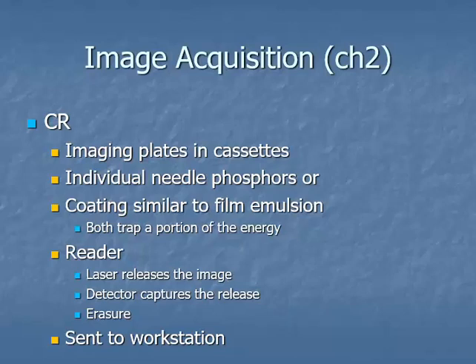If you see a question about computed radiography, it'll just be abbreviated CR. Most of the industry standards are making a shift to lump them all together into digital, but that's our way of identifying the different technologies.